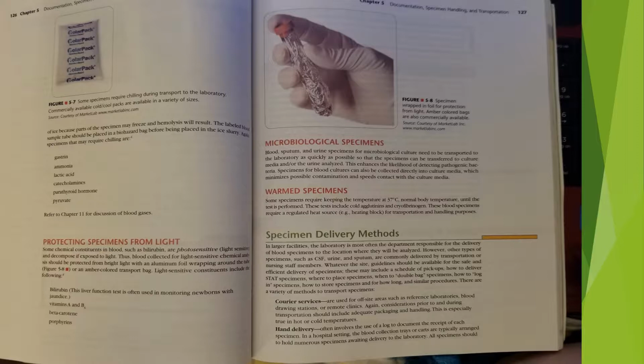Some specimens require the temperature at 37 degrees Celsius or normal body temperature until the test is performed. These tests include cold agglutinins and cryofibrinogen. These blood specimens require a regulated heat source, such as a heating block, for transportation and handling purposes.